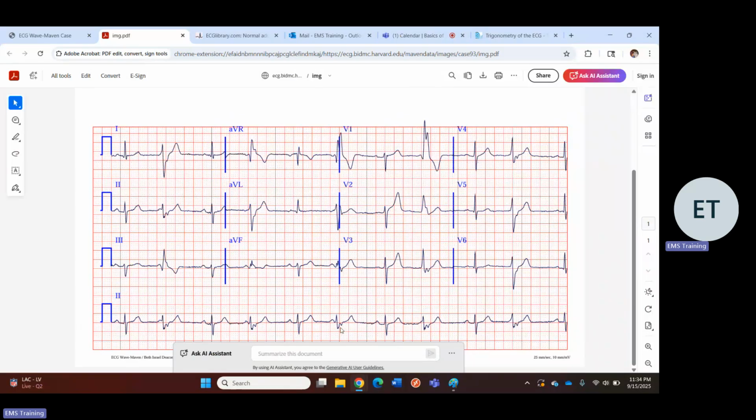Very interesting. If this is a premature junctional complex, why is there a P wave in front of it? It's almost as if there's intermittent independent atrial and ventricular activity. Huh. Very strange. This might be, maybe not a complete heart block, but is this a complete heart block and every single other beat is a fusion beat? Whoa. This is tough. Could it be due to an MI?